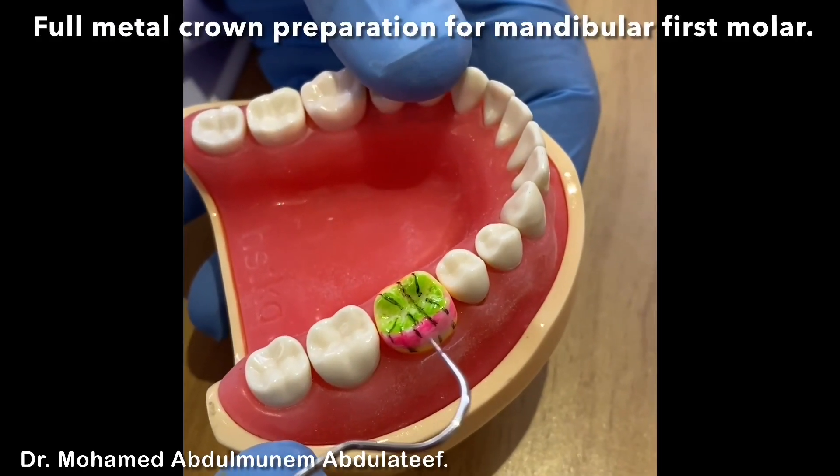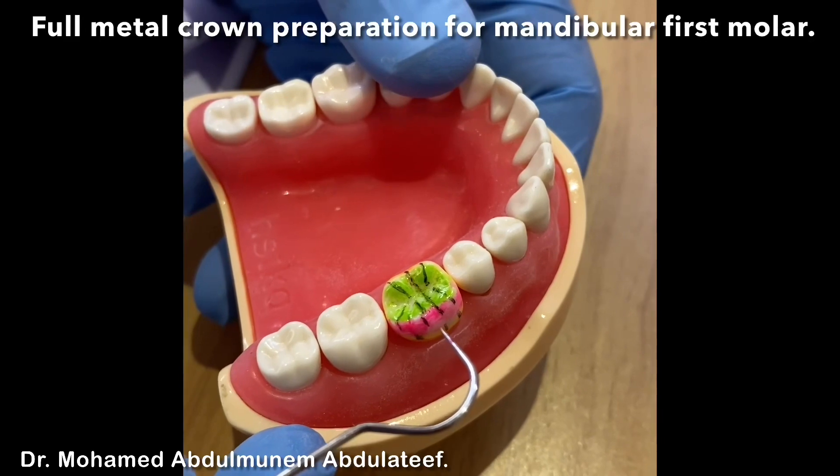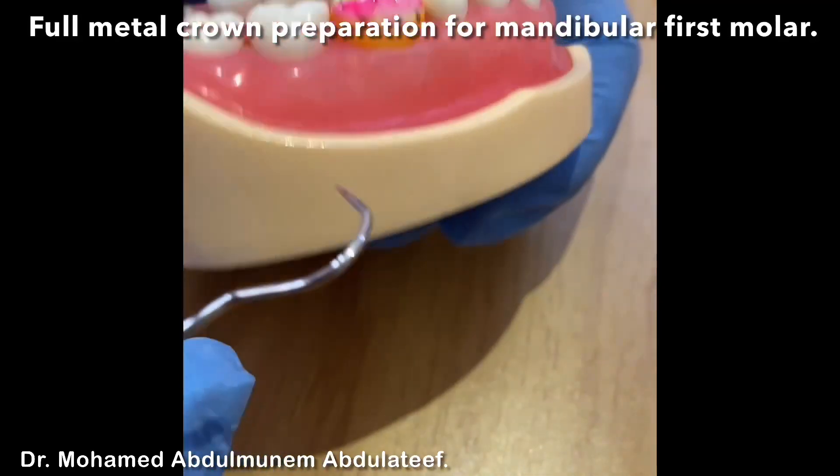Assalamu alaikum. Today we'll do a demonstration for tooth preparation for metal crown for lower six.